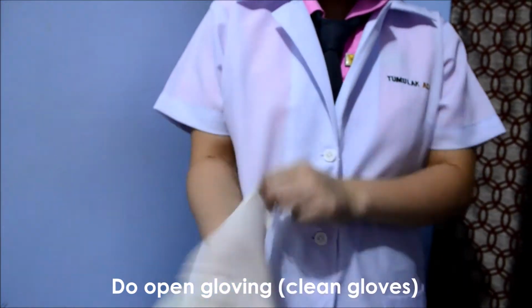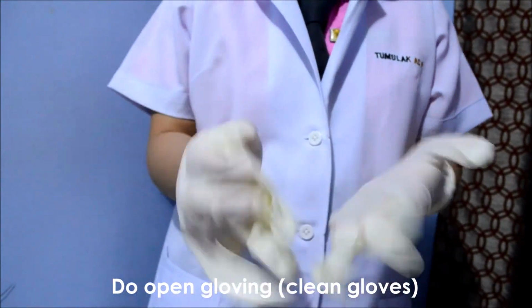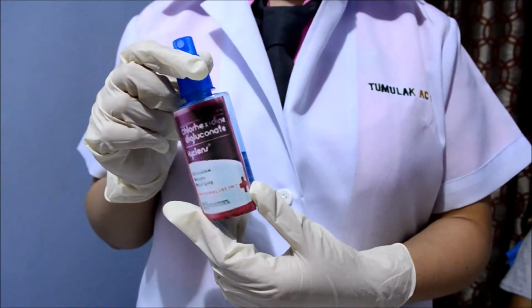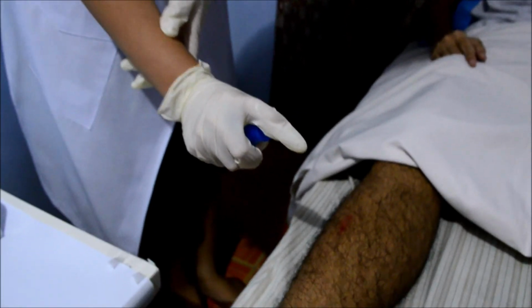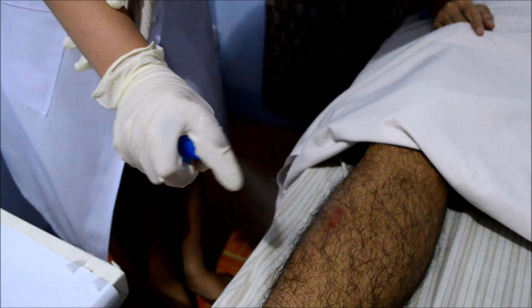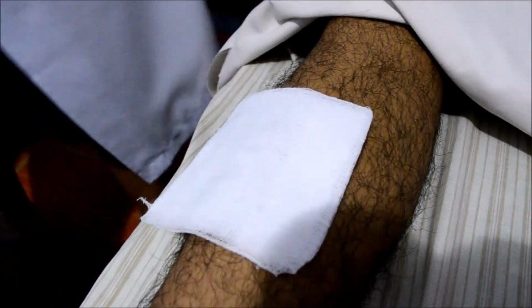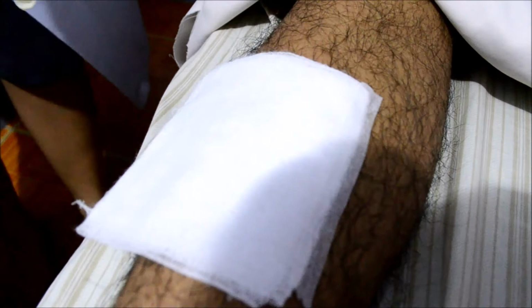Do open gloving using clean gloves. Get the spray and position the nozzle 2 to 3 inches away from the wound, and let the patient turn his head away. And then, pick up the gauze with a pick-up forceps and gently place it over the wound area and secure it with a plaster.